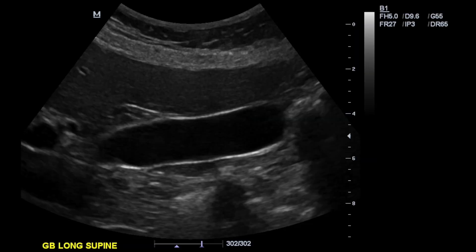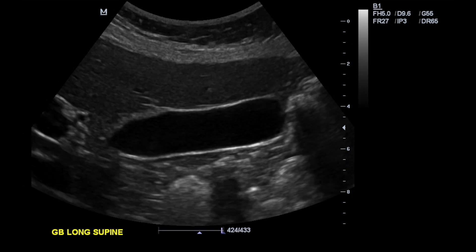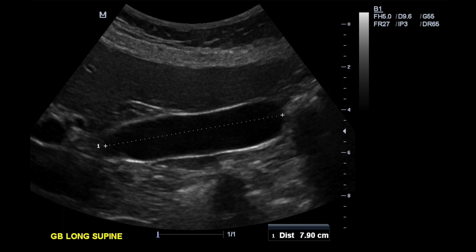Here's our first image of the gallbladder. We're looking in the long plane with the patient supine — flat on their back — and the ultrasound probe is vertical on the patient. The left side of the screen is toward the patient's head, the right side toward the patient's feet, the top toward the patient's front, and the bottom toward the patient's back. The gallbladder is that black oval in the middle of the screen. We try to get three pictures of it in different views and choose the largest portion to measure.